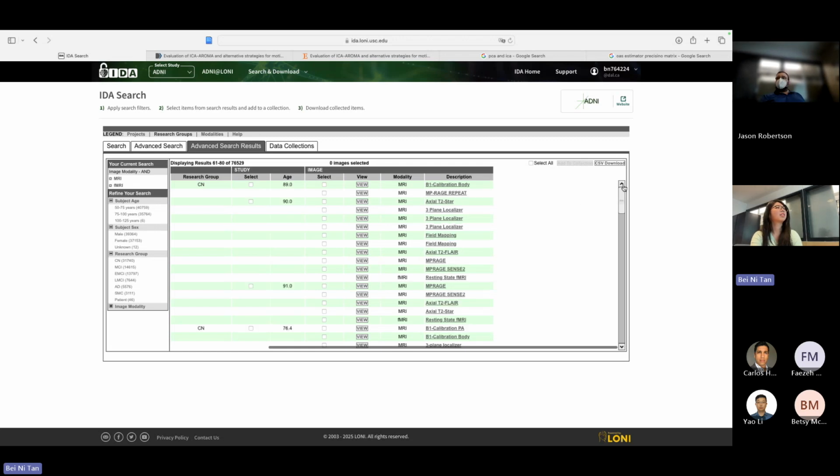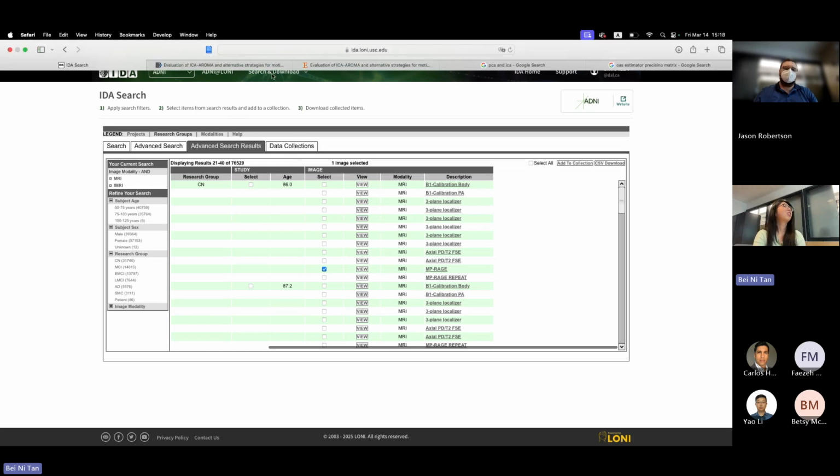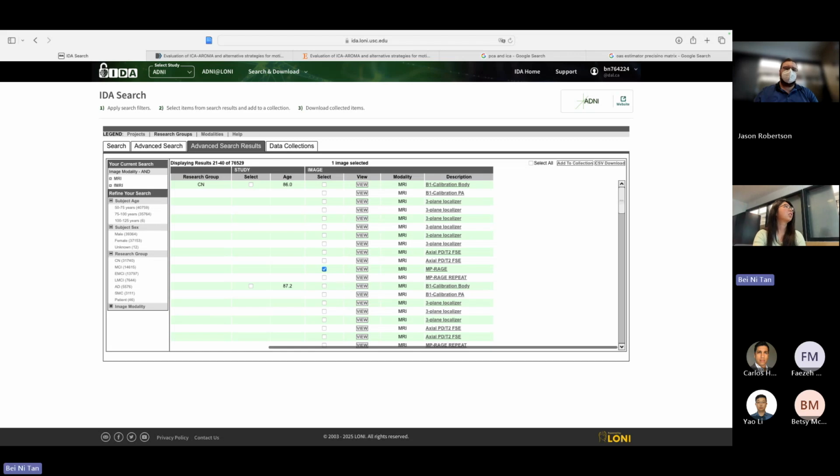Eventually whoever is trying to download data needs to navigate the website, right? So now you download the data. What is the next step? You just download it, and denoise it using the script you provided.